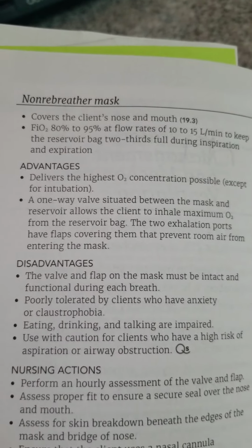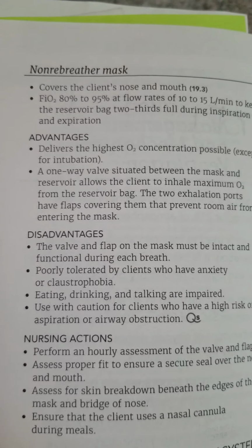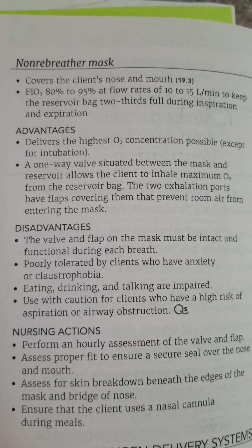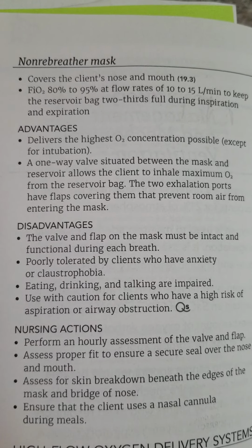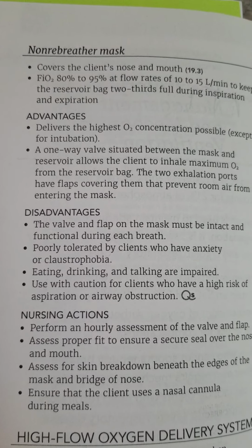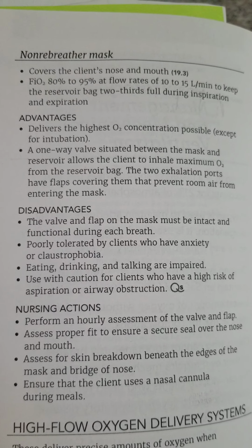The non-rebreather mask covers the client's nose and mouth. FiO2, 80 to 95% at flow rates of 10 to 15 liters per minute to keep the reservoir bag 2/3 full during inspiration and expiration. Advantages is that it delivers the highest O2 concentration possible except for intubation.